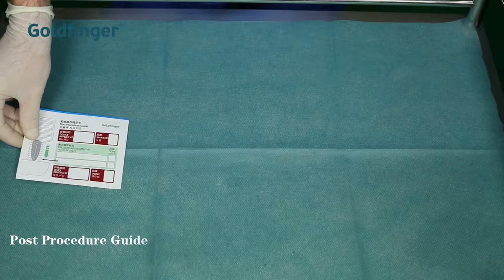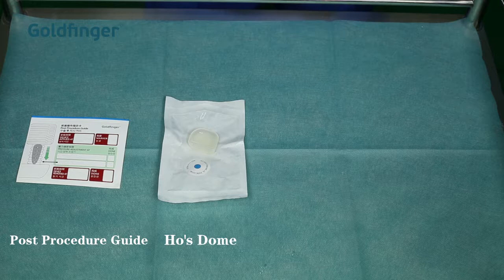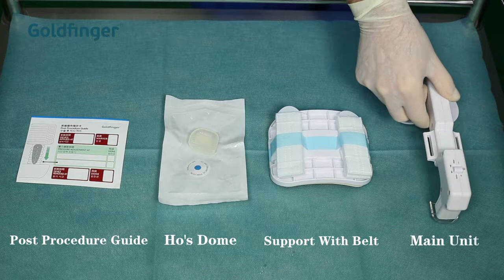Each package of Goldfinger contains a post-procedure guide, a Ho's Dome, support with belt, and the main unit.